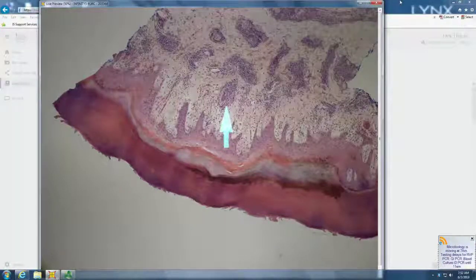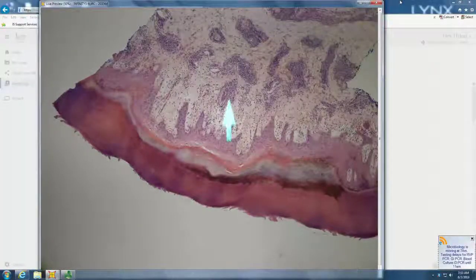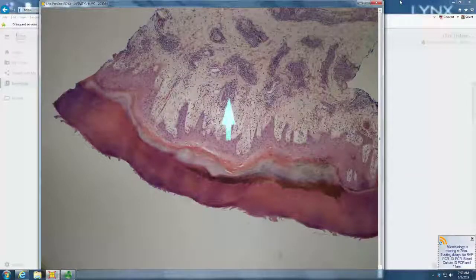Every lymphocyte has its own identity around the vessel. PMLE with the dermal edema. So papillodermal edema with neutrophils, Sweet's; with lymphs, PMLE; acral with lymphs and fluffy edema around the vessel, perniosis. Okay. So perniosis and PMLE look exactly the same, except that one's on acral skin and has the characteristic fluffy edema, which you don't get in PMLE.